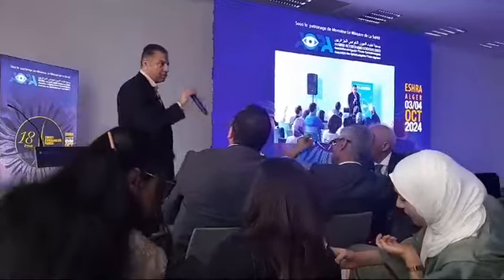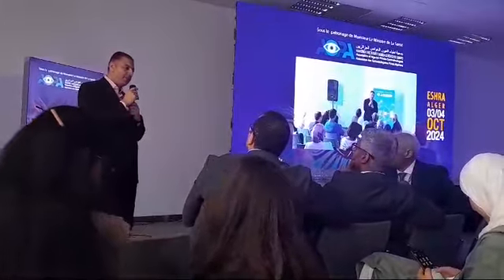Do you use in your daily practice a check of the biomechanics of the cornea before laser, even for surface ablation, or is it just for LASIK? Actually, I don't have the Corvis in my center. I have the MS39, so the epithelial mapping helps me a lot. But if I suspect, even with the epithelial mapping, I will send for Corvis, but not routinely. But epithelial mapping is routine.